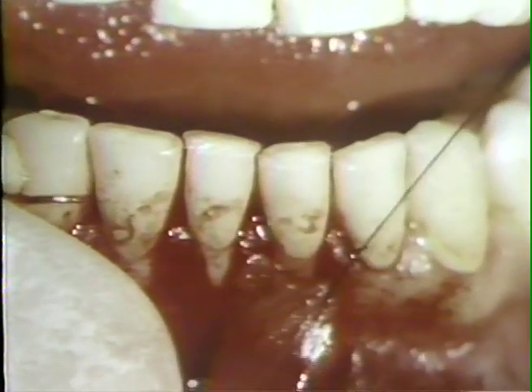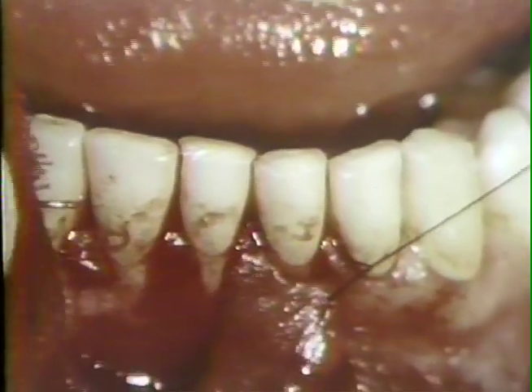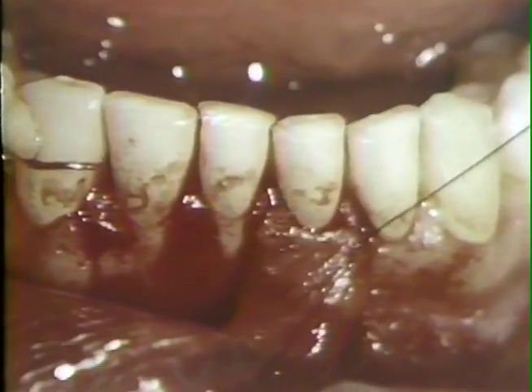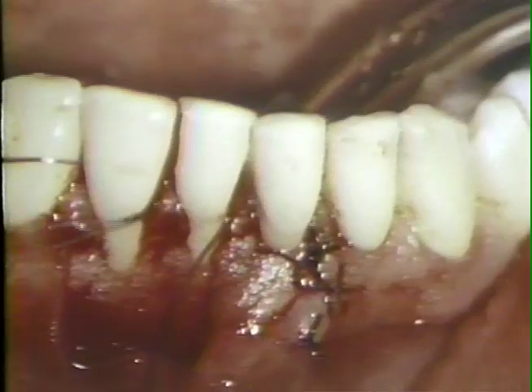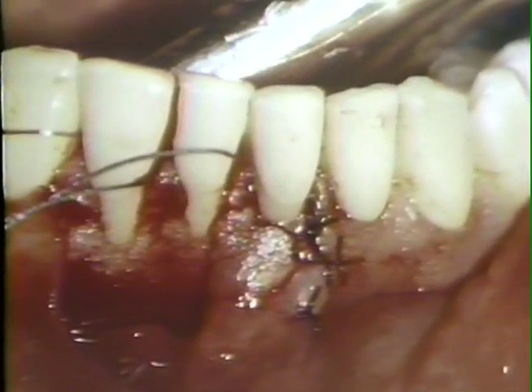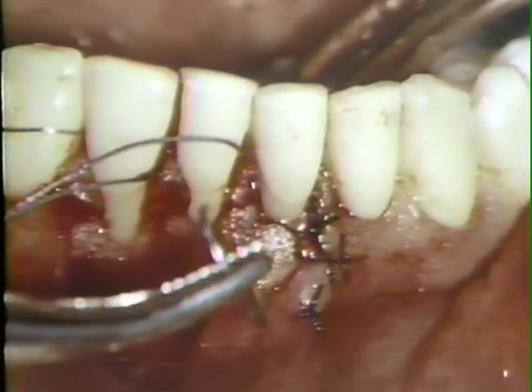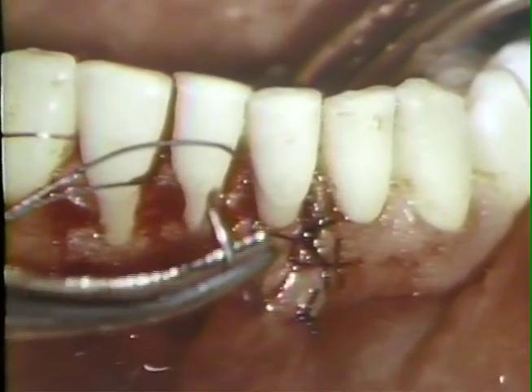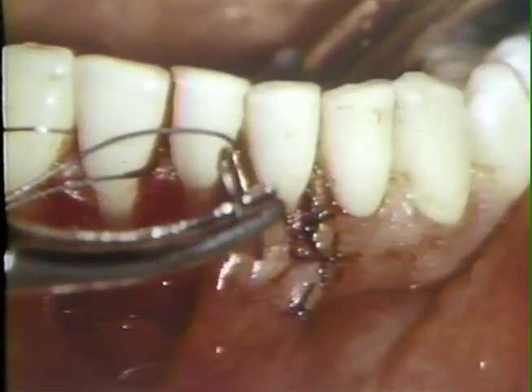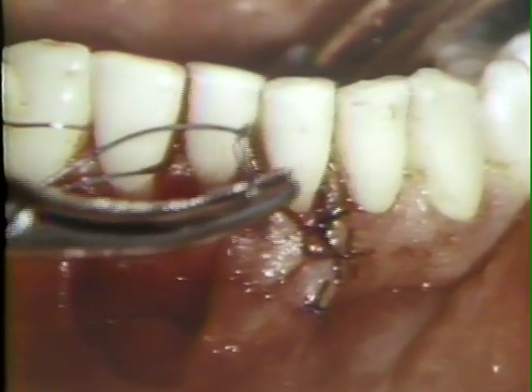Sutures are also placed along the vertical incision, joining the pedicle flap to the gingival tissue on the mesial surface of the lateral incisor. The suture is then placed around the lingual aspect of the adjacent central incisor. The needle is inserted through the mesial corner of the flap and carried through the interproximal space between the two central incisors to the lingual side.